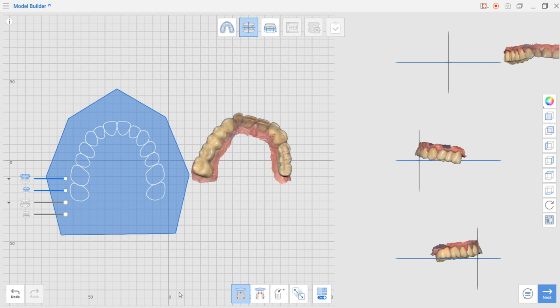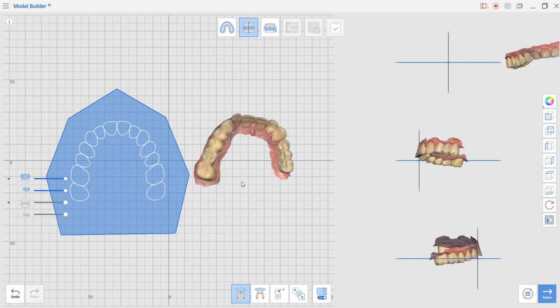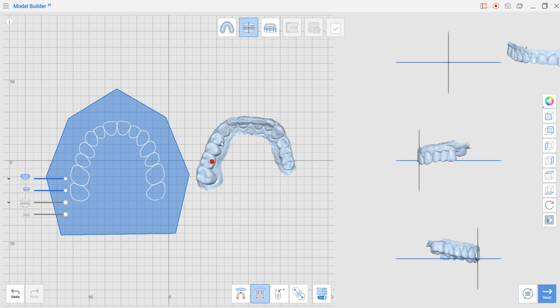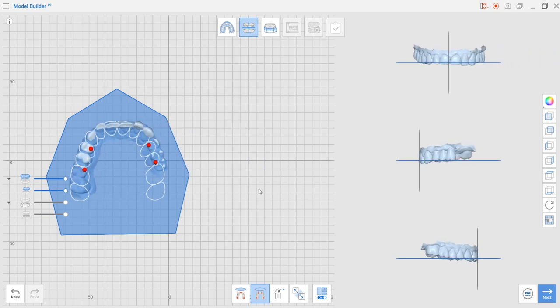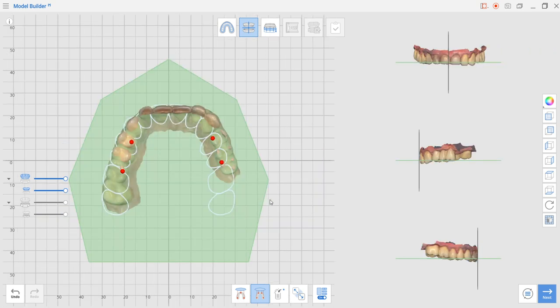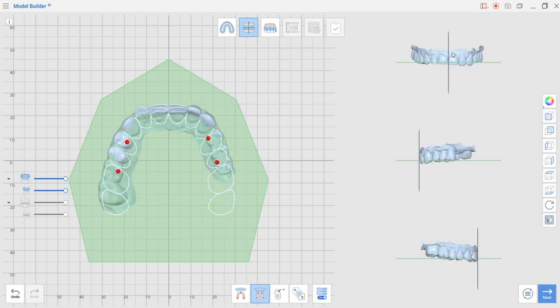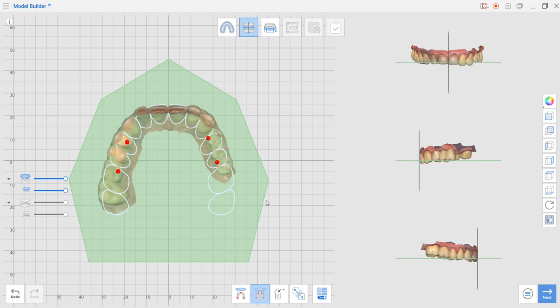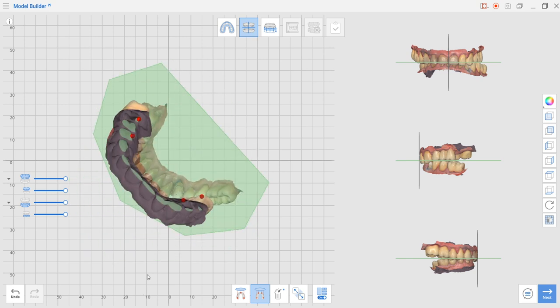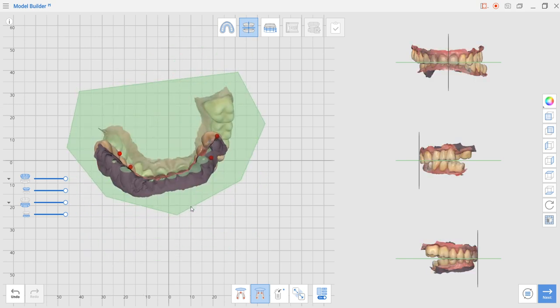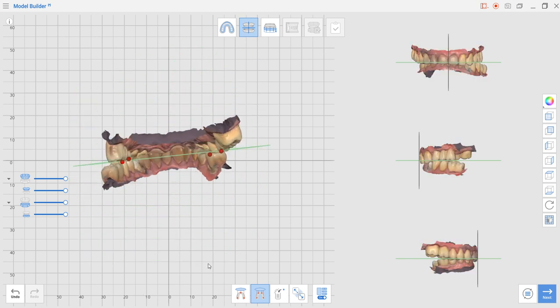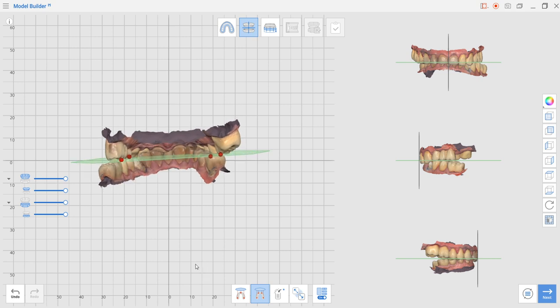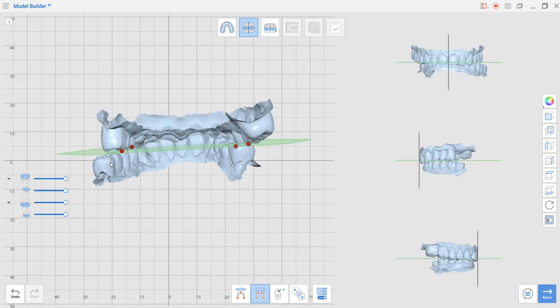Here we are going to be able to select the positioning to this plane with three or four points. I'm going to select the four points. I think it's better in this case. Let's just add the points. The model comes in nice. I'm going to just adjust it a little bit. If I like to check the relationship between occlusal plane and both models, I can select or deselect it from the left side.